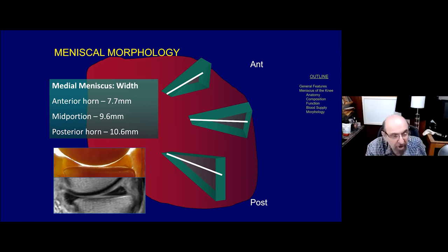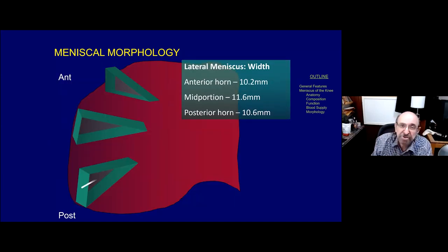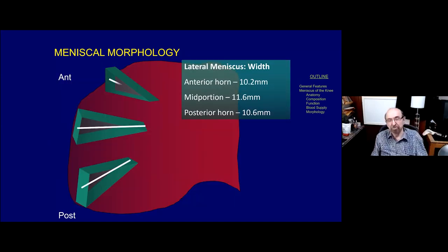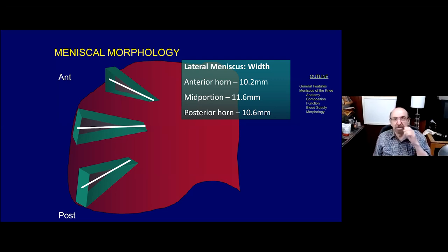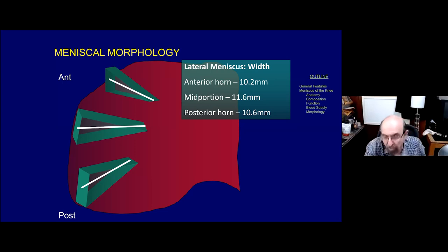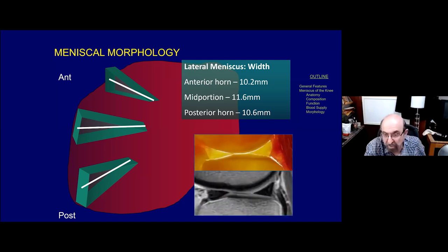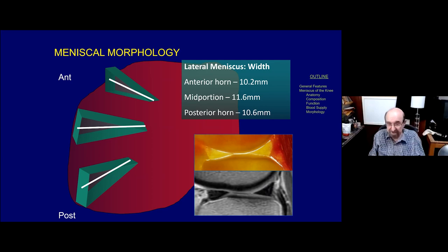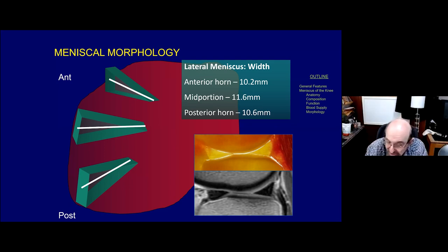If we do the same experiment on the lateral side, the results are different. The widest portion of the lateral meniscus tends to be its mid-portion or body, with the posterior horn and anterior horn being similar in width. So a quick survey of lateral meniscus integrity on a sagittal image is that the width of the posterior horn should be about the same as the width of the anterior horn.